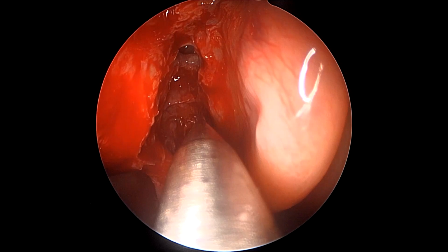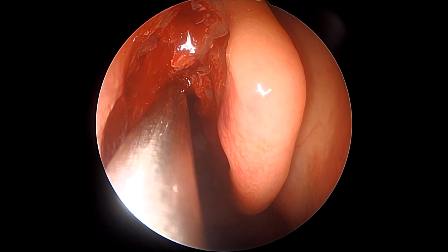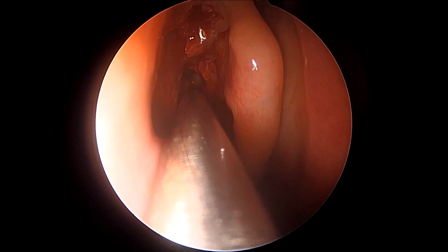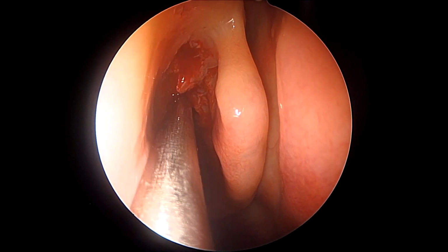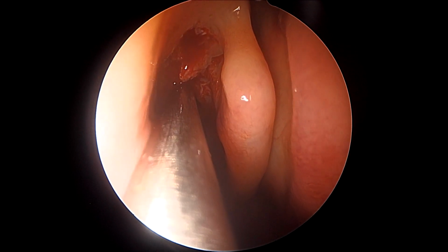Now here we are using a navigator probe to once again reorient us towards the anatomy. That would be the anterior ethmoidal region, the anterior ethmoidal skull base. As you can see, it is still behind the region of the agger nasi and the frontal recess.